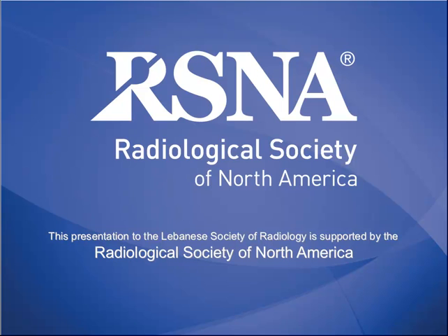Thank you. The dual CT of Siemens is a little different from GE, because they use one at 80 kV and the other at 120 kV, and they combine them. Yes. So there's even the ability to get images with 2 different kVs, so you can get a non-contrast image for free, so to speak.